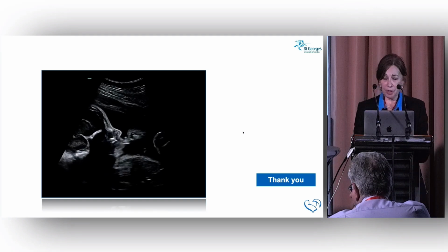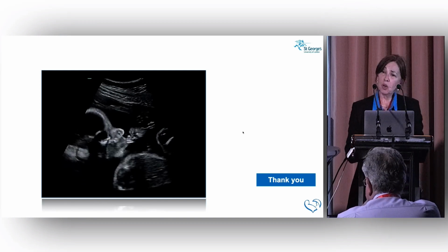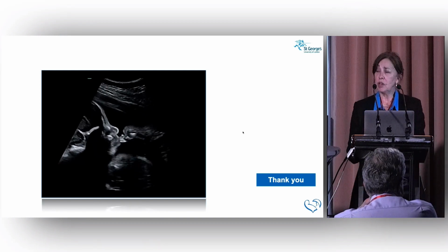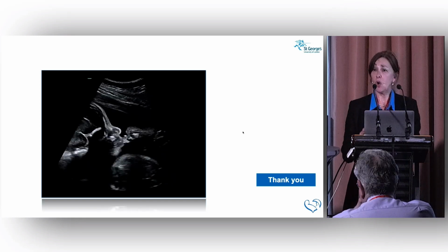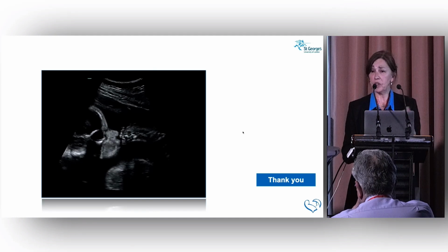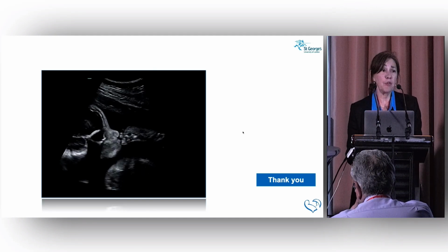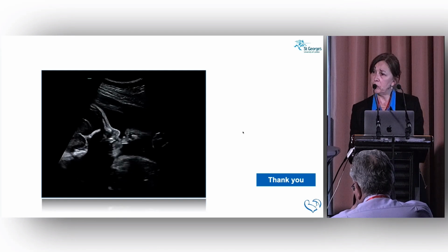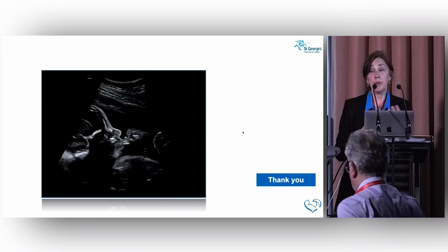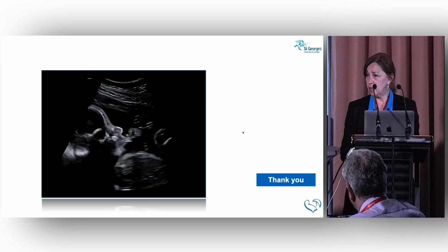Yeah, look at this baby enjoying sucking his big toe there. So all of these cases I showed you, in utero, they're fine. A lot of them can go home after birth, and then we deal with the problem afterwards, like in a subaortic VSD with no pulmonary stenosis. It's just like a VSD. But if you have one with double outlet right ventricle, subaortic VSD and coarctation, the baby needs to be on prostaglandin. It needs to have a shunt before it goes home or a stent of the duct.